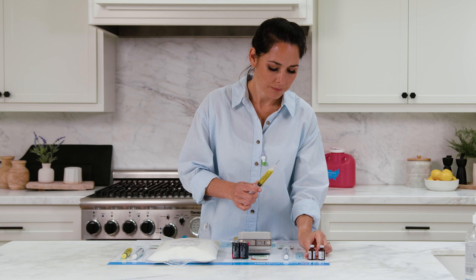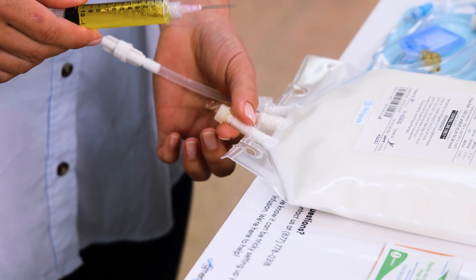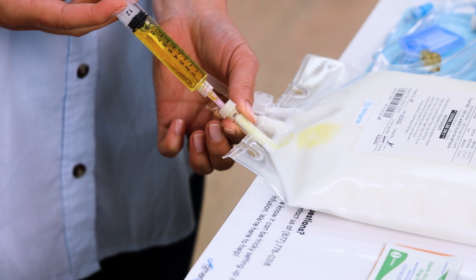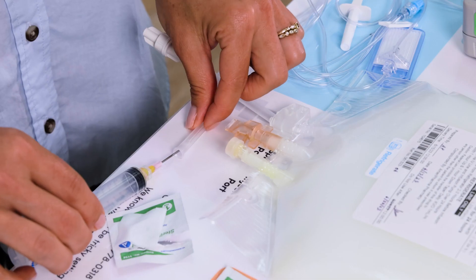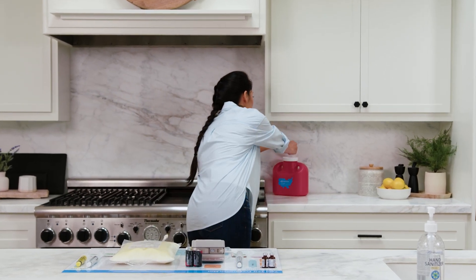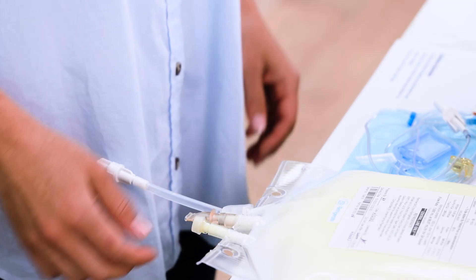Remove the syringe from the second vial and, while keeping the needle tip facing up, tap the syringe and push the plunger to expel any air. Insert the needle into the center of the injection port of the TPN bag and inject the medication. Repeat the same instructions for any additional additives. Use the scoop method to recap the needle. Once capped, unscrew it from the plastic syringe, discard the syringe in the trash and the needle in a sharps container. Gently massage the bag a few times to mix the medication.